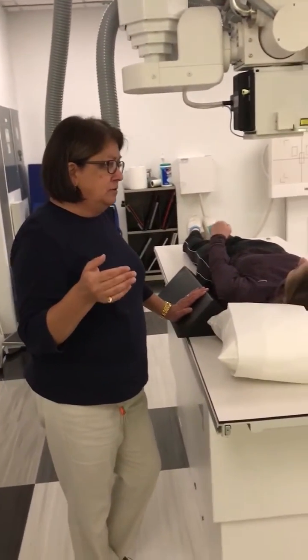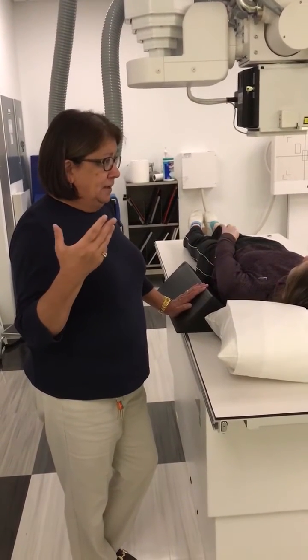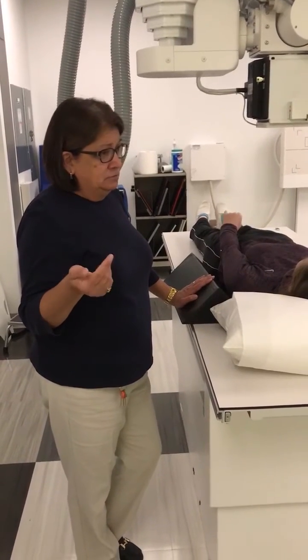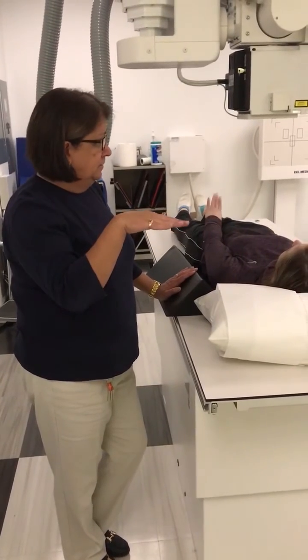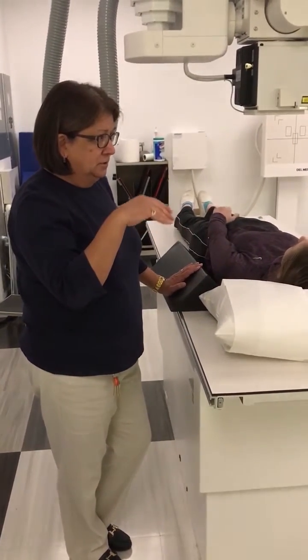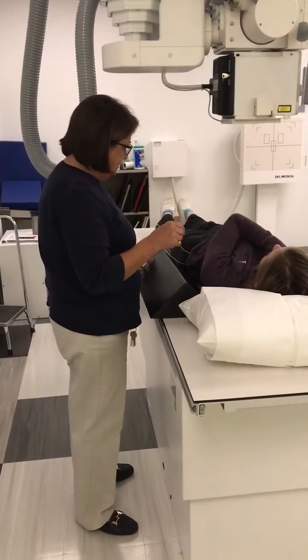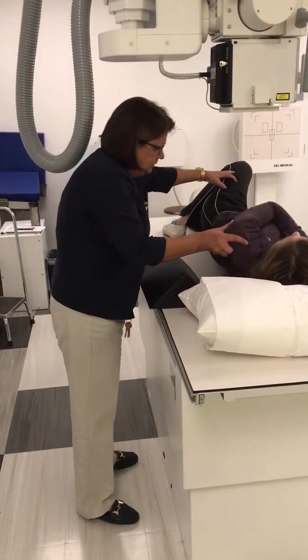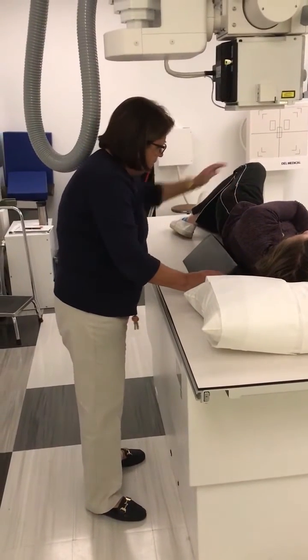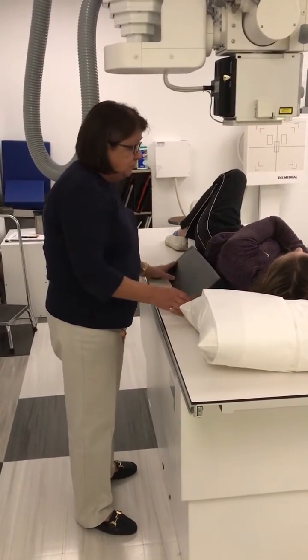For the IVU, we're using a more shallow oblique than we had before, only 30 degrees. And we talked Monday about why that is. Our objective is to place the upside kidney parallel to the IR. So a 30-degree angle should do that. Place your left arm across your chest, lift up your left leg. I'm just going to roll you slightly. I'm going to put this sponge behind you. Go ahead and lie back. That's a pretty shallow oblique.